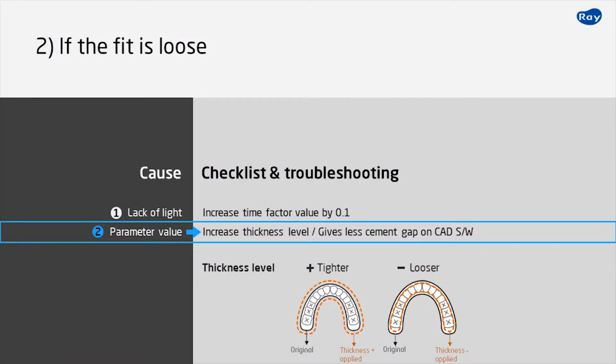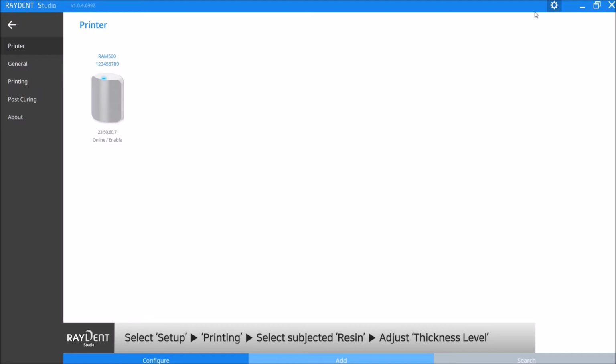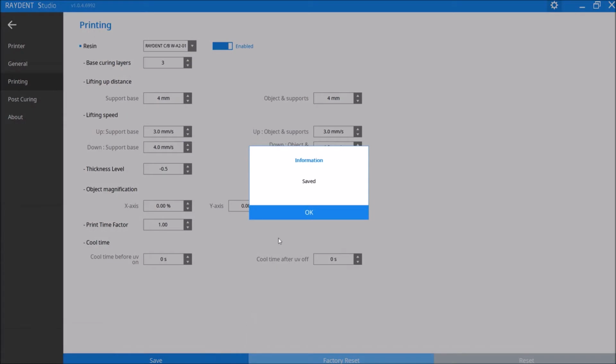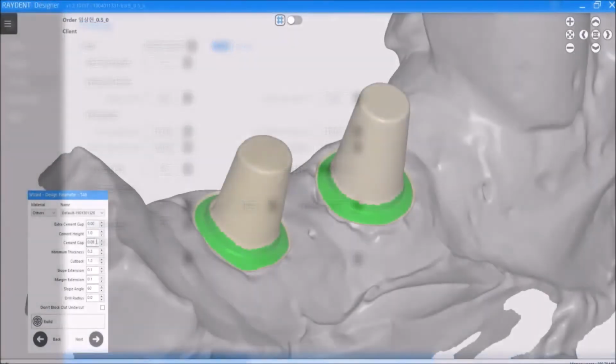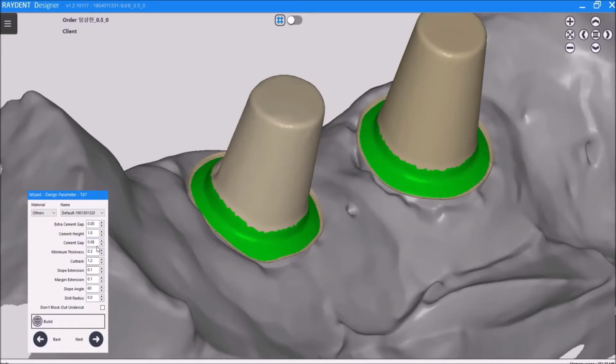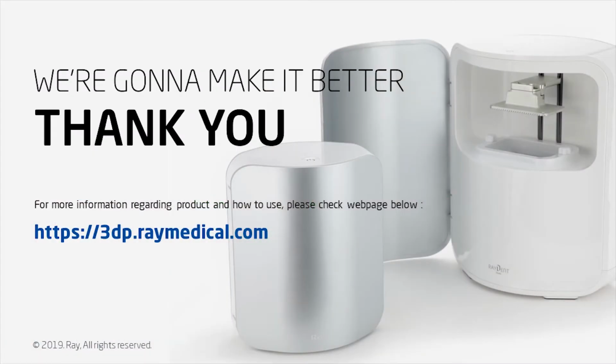Another way to make it tighter is adjusting the thickness level value. Go to Setup in the upper right corner of Studio and click on Printing in the left menu and select the resin type at the top and increase the thickness level by 0.5 and reprint to confirm the fit. Increasing the thickness level will make the print tighter. Decreasing the thickness level will make the print looser. If you decrease the cement gap from CAD software, the fit will be tighter too.